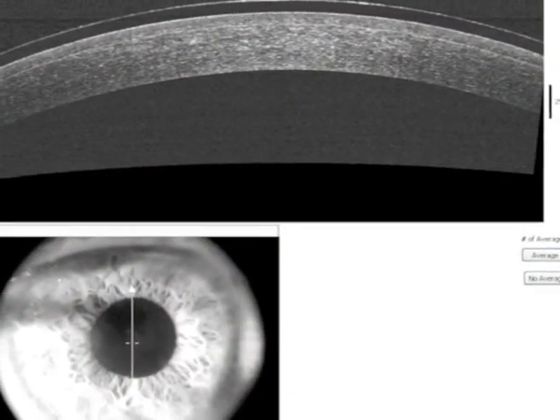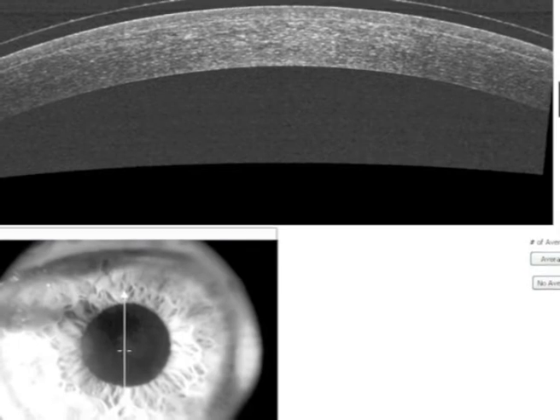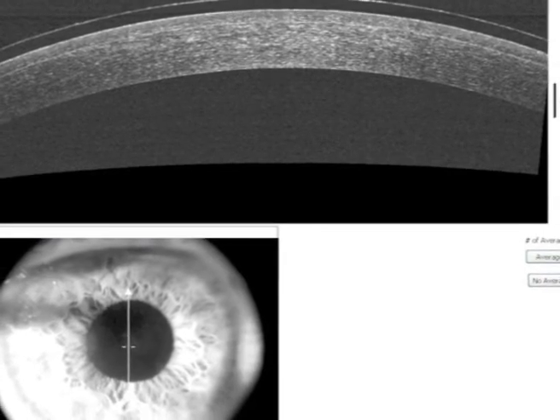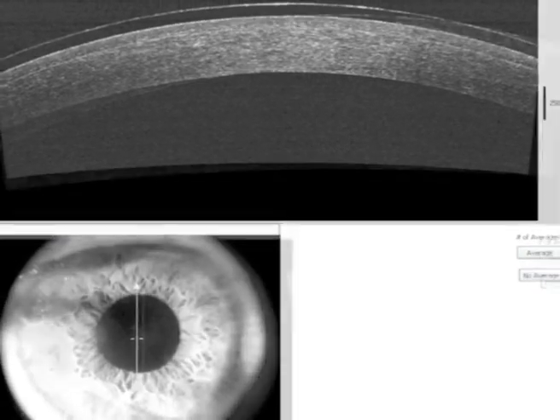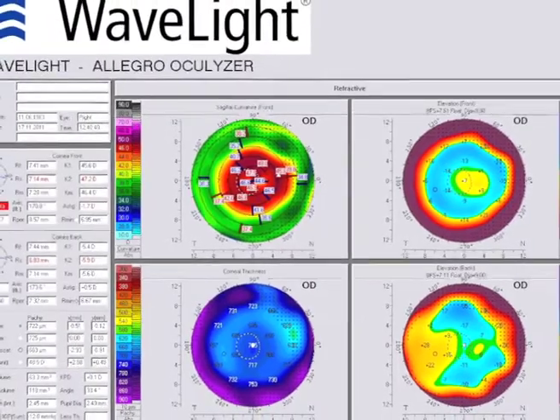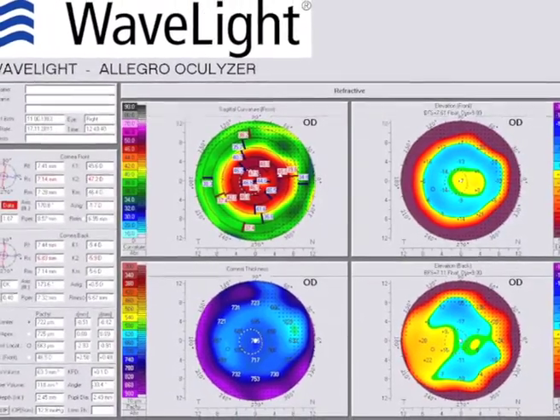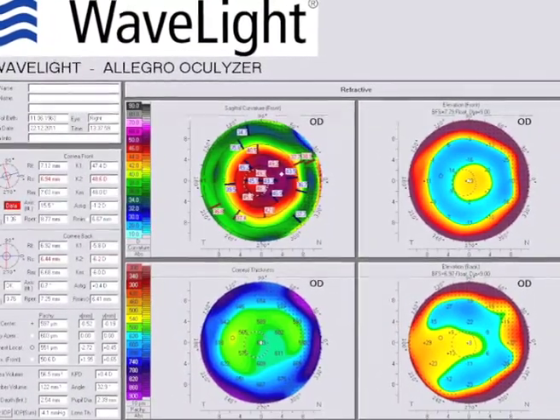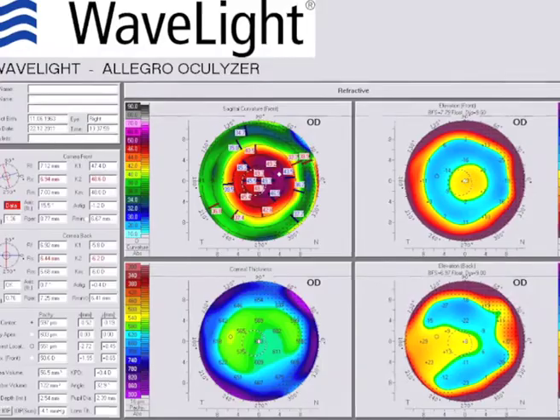This is the patient immediately after surgery — you can see the bandage lens and the hyperreflective interface. At one week and one month post-operative, the refractive result is very stable: 20/20 uncorrected despite the high correction. On OCT several months later, you can see the hyperreflective interface depicting the cross-linking effect.